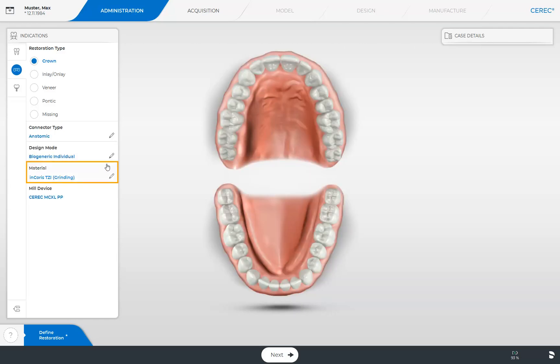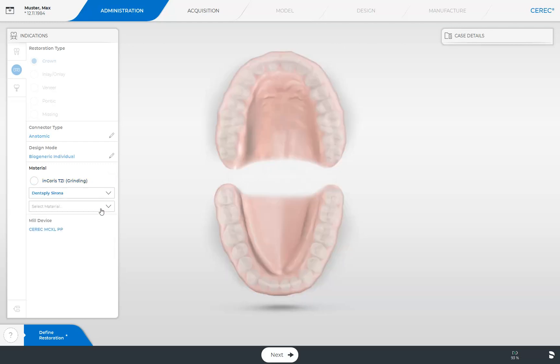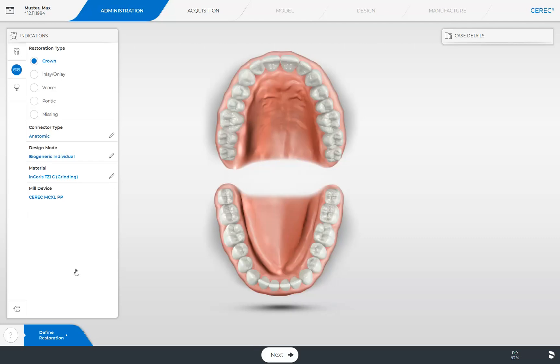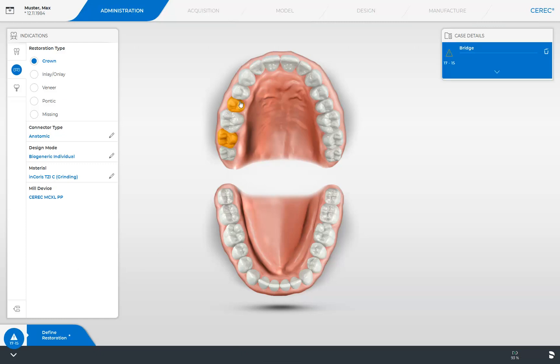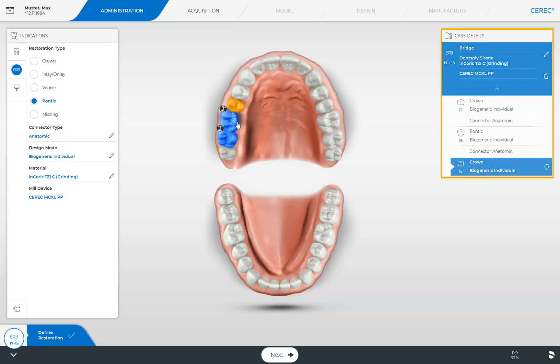Then we select the material. Our odontogram is displayed so that we can define the crown positions of our bridge first. In the window under Case Details, a triangle marked in orange is now displayed, indicating that the bridge restoration has not been fully defined yet. This means we turn on the Pontic option next and tap the matching position in the odontogram. The complete bridge restoration is displayed to the right in the window under Case Details. To modify single elements of the bridge, we can click on the position in Case Details or select the element in the odontogram. The connectors are marked with a black circle and can be changed with just one click.